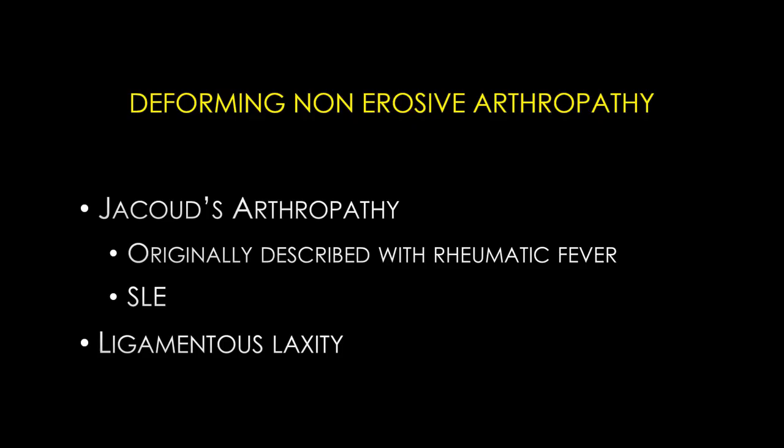So this is what we call a deforming but non-erosive arthropathy, also known as Jaccoud's arthropathy. Jaccoud's arthropathy was originally described with rheumatic fever, but nowadays is most commonly seen with lupus. Only 5 to 40 percent of lupus patients present with deforming non-erosive arthropathy; the most common musculoskeletal presentation is polyarticular arthropathy similar to rheumatoid arthritis. This deforming ulnar subluxation is due to ligamentous laxity and usually reduces when patients press their hands against a table. The important thing is that there are no erosions.